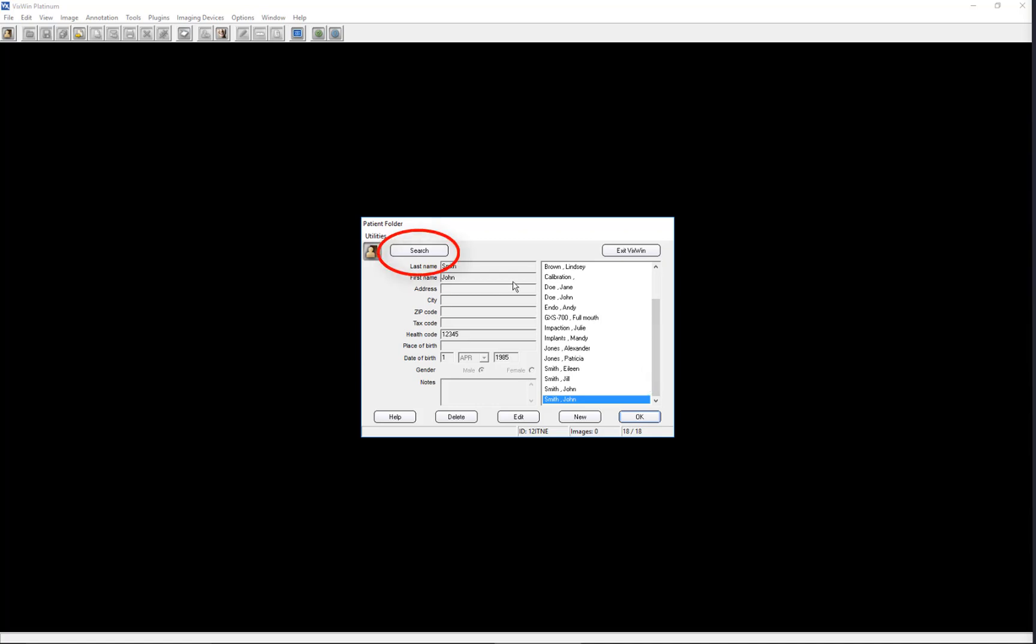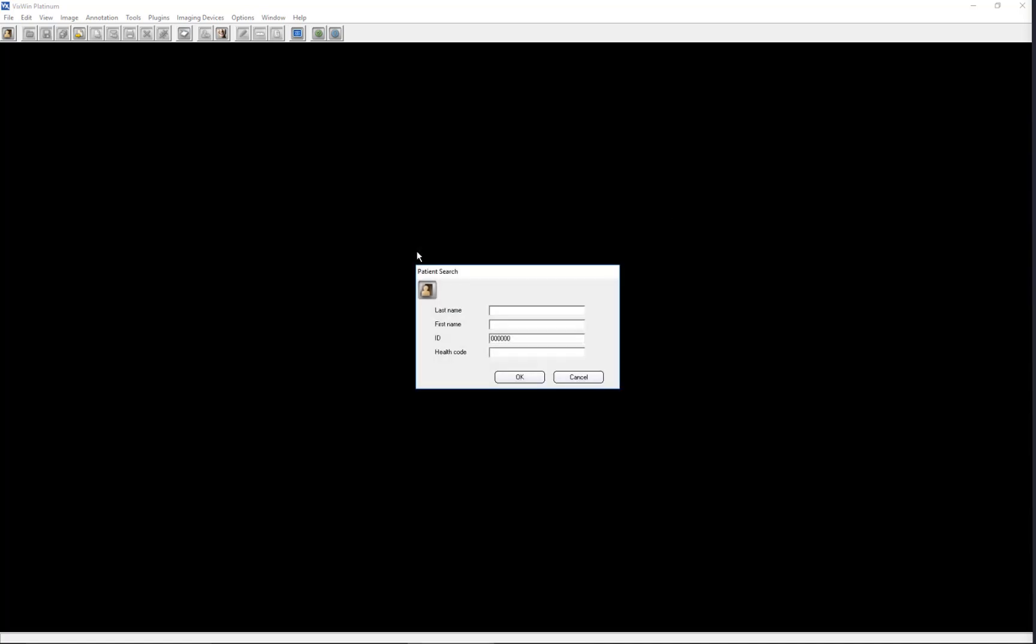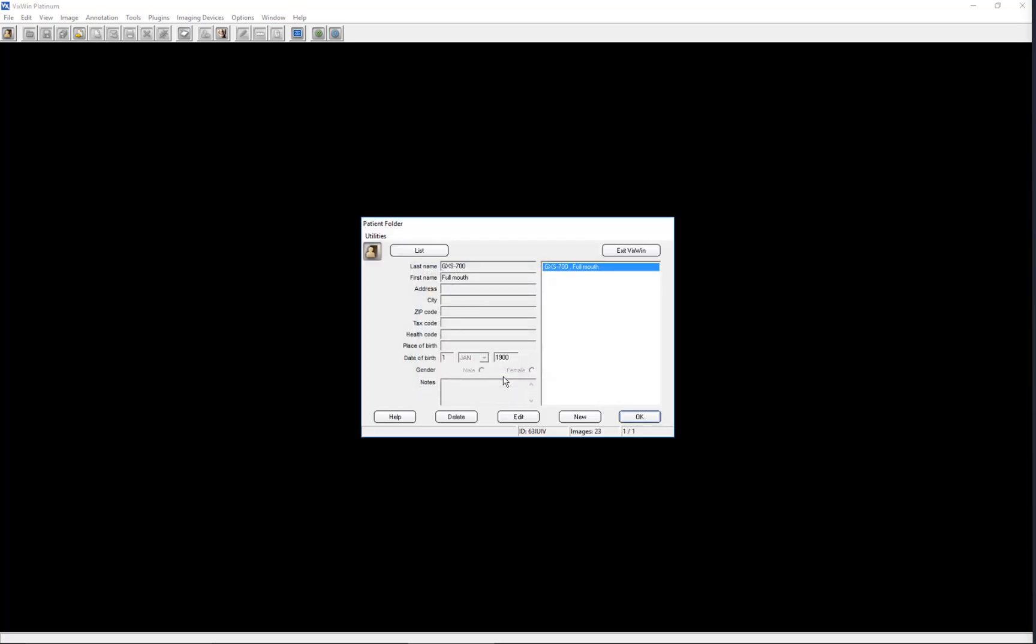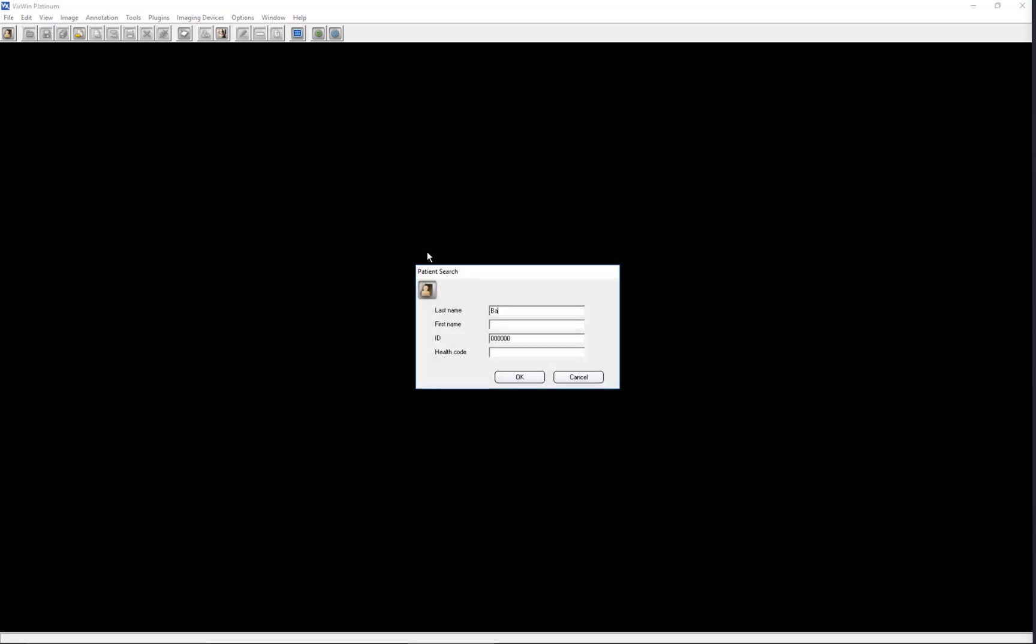To locate a patient record, click Search, then enter the patient's name or other pertinent information, then click OK. Click List to enter another query and repeat the search sequence.